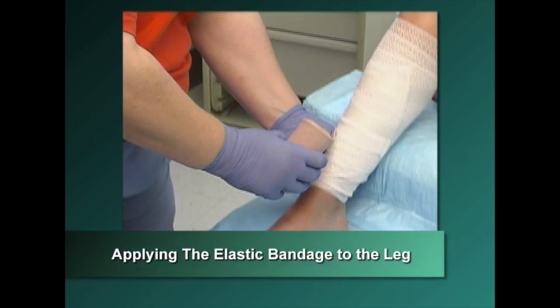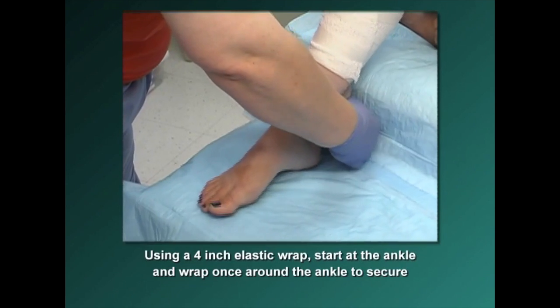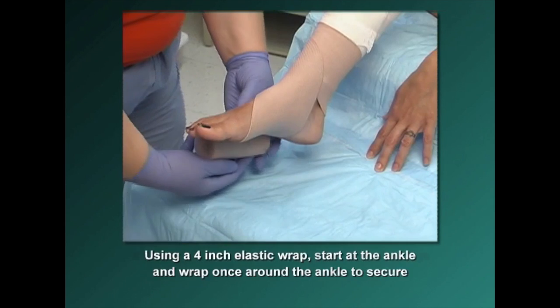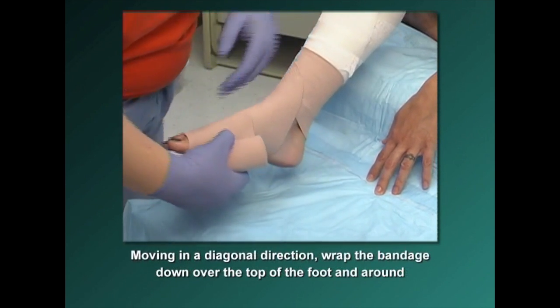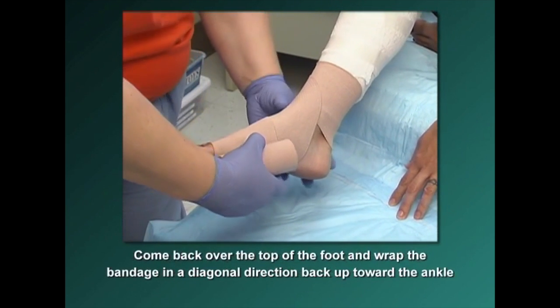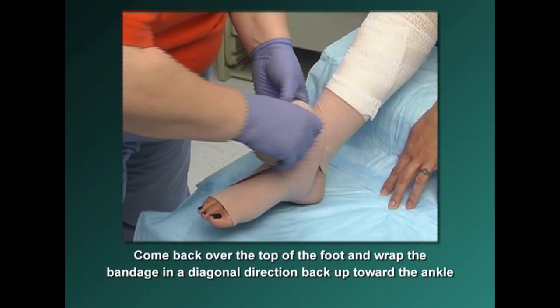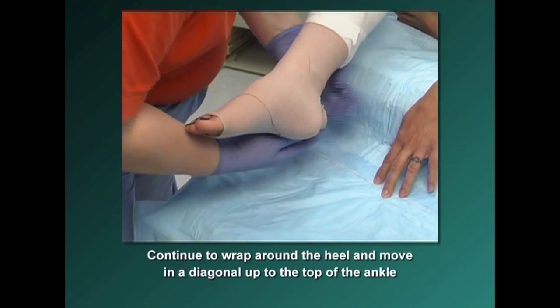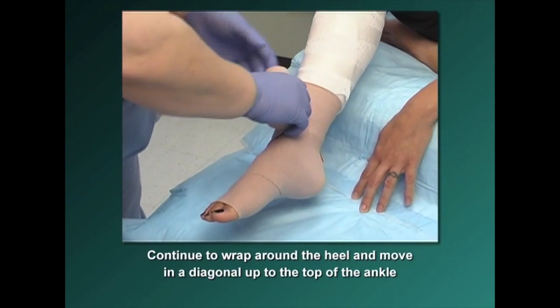To apply an elastic bandage to the lower extremity, using a 4-inch elastic wrap, start at the ankle and wrap the bandage once around the ankle to secure. Moving in a diagonal direction, wrap the bandage down over the top of the foot and around, then come back over the top of the foot and wrap diagonally back up toward the ankle. You should be crossing over the top of the foot and making an X with the layers of the elastic bandage. Continue to wrap around the heel and move diagonally up to the top of the ankle.